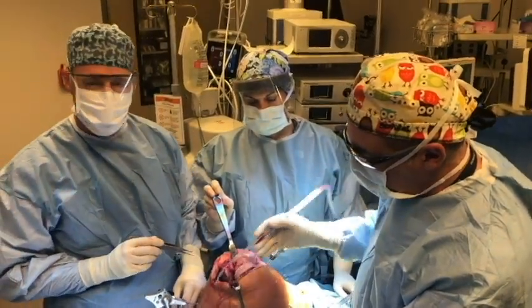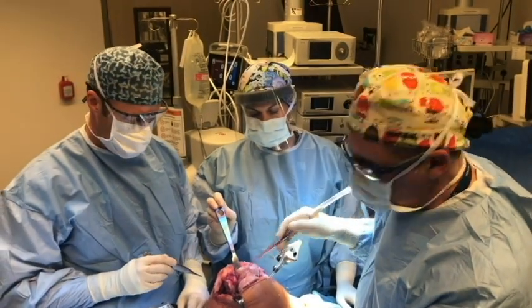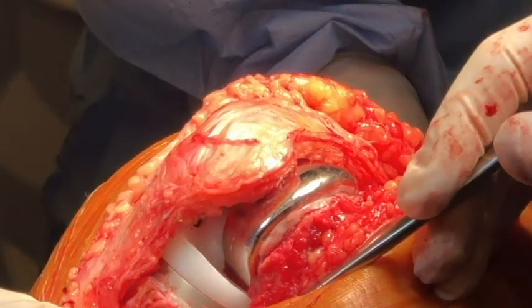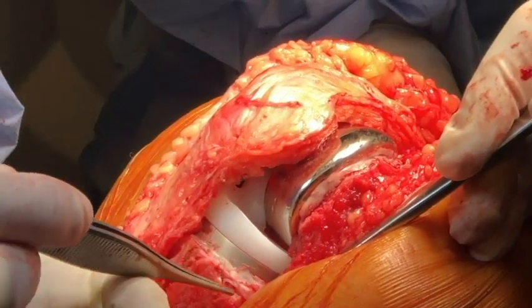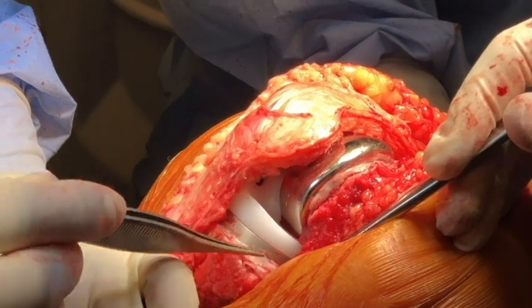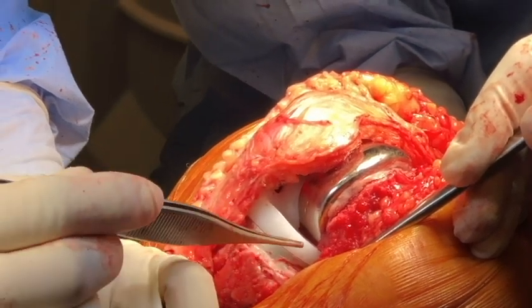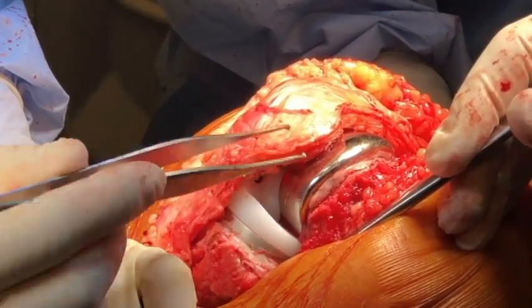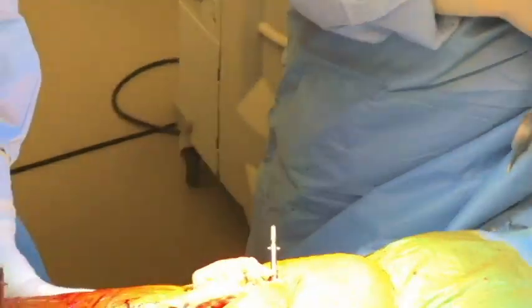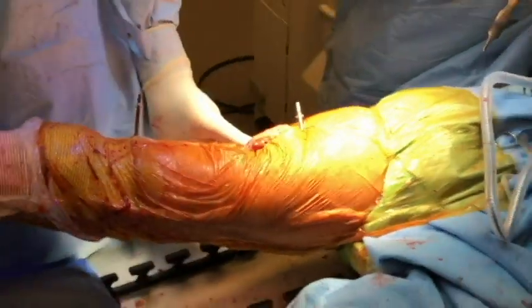And that's why the leg goes bow-legged when she stands, because there's no bone here to support it. The total knee replacement is in place. You can see here the cement has built up that defect. Underneath that, there's a screw supporting the most medial aspect of the implant. You can see here's the tibial tray, the plastic, the femoral component, and the cement. And if you just watch closely, that leg that used to be crooked is now perfectly straight.